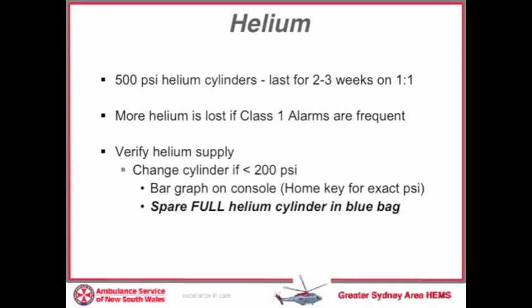Regarding the helium supply, a 500 psi helium cylinder will last several weeks on 1:1. We recommend changing the cylinder if the psi drops below 200. A spare full cylinder is kept in the blue bag attached to the pump.